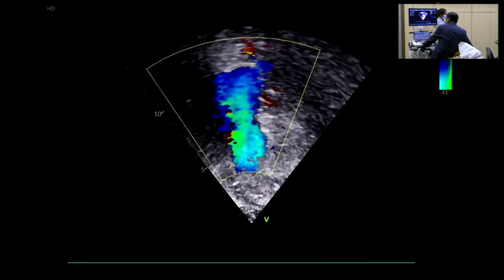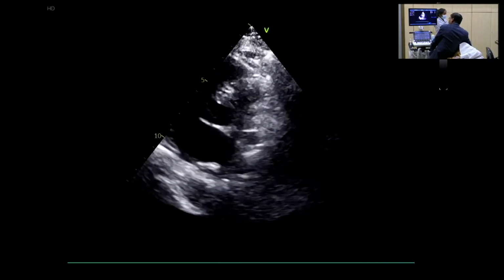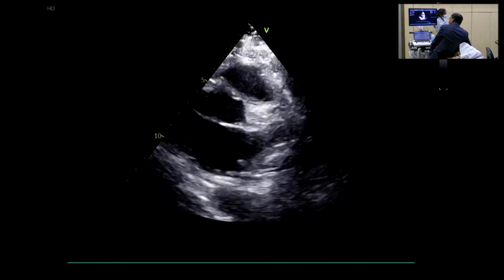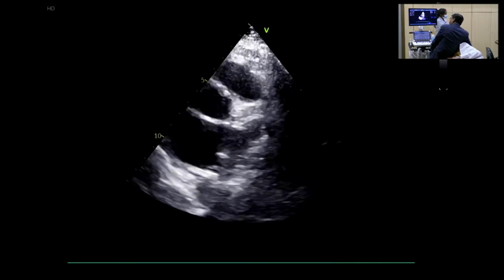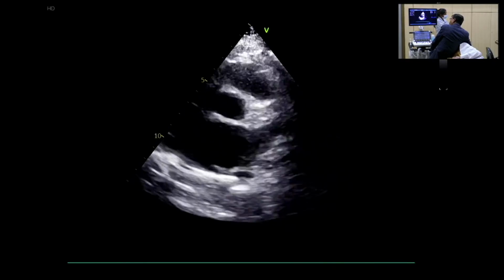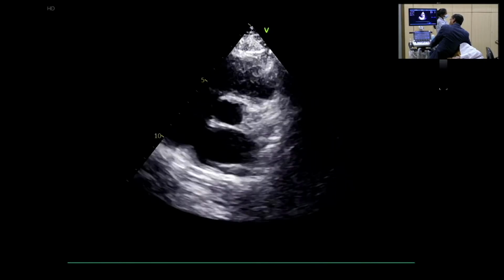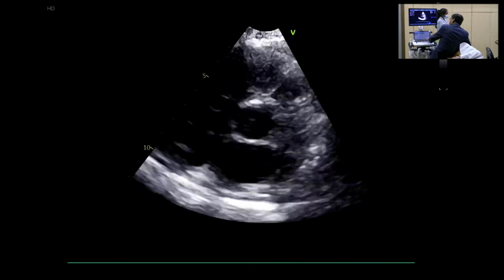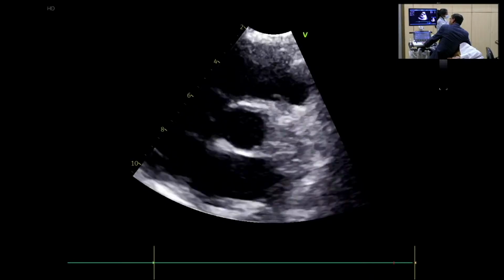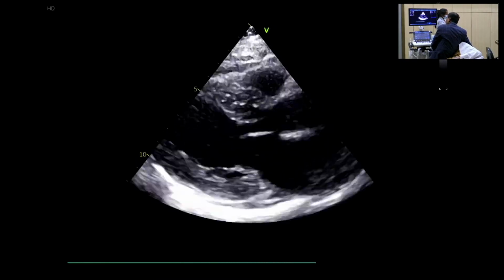Yes, yes. Mostly we have bicuspid aortic valve. So let me try to profile. Not accustomed with adults, so. It's difficult to profile this bicuspid aortic valve because flow velocity is higher in this patient. It's about 1.9, 1.8 meters per second. Zooming, yes, but still I am not able to see. I will see some other views. Okay, I will come back to this. Let me do this first.